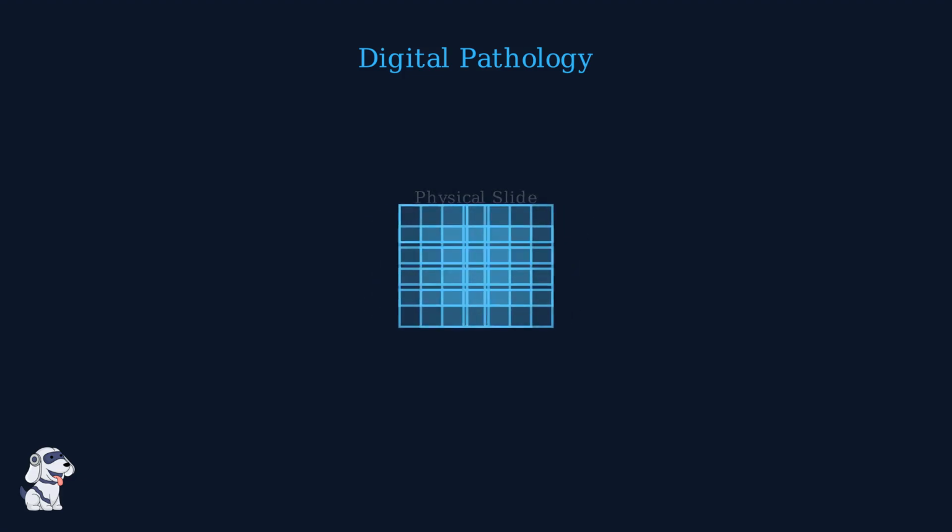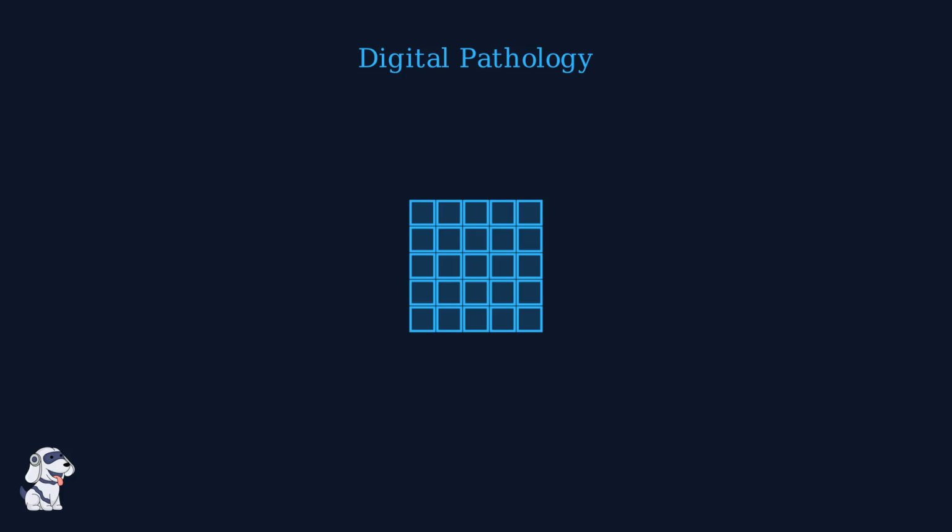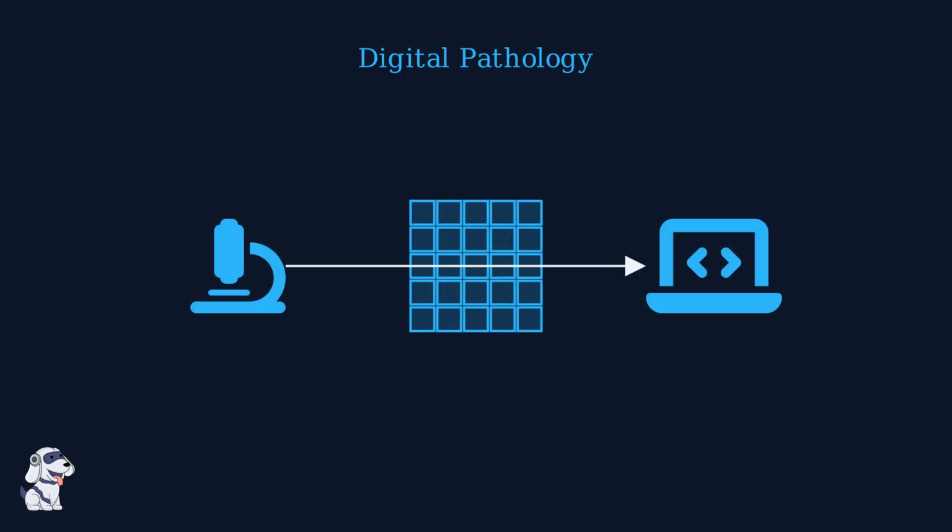Traditionally, pathologists examined physical glass slides under a microscope. Now, we use high-resolution scanners to create virtual slides. A virtual slide is a massive, high-fidelity digital image of the entire specimen. This allows pathologists to zoom into any region with extreme clarity. This technology enables remote diagnosis.